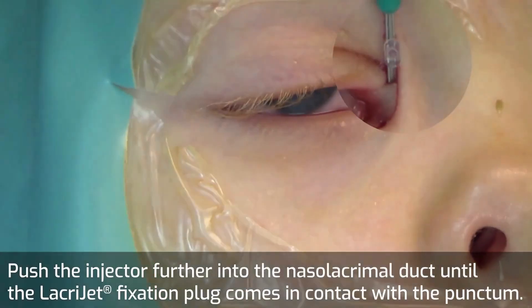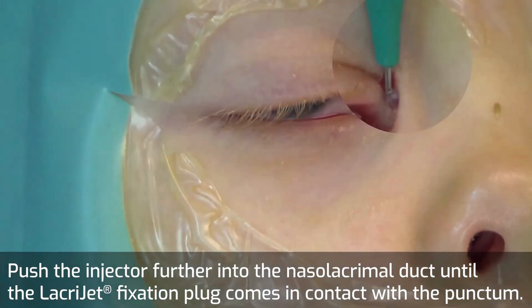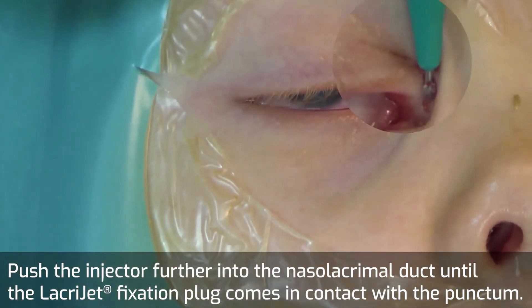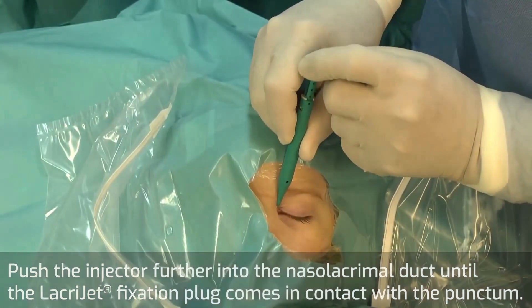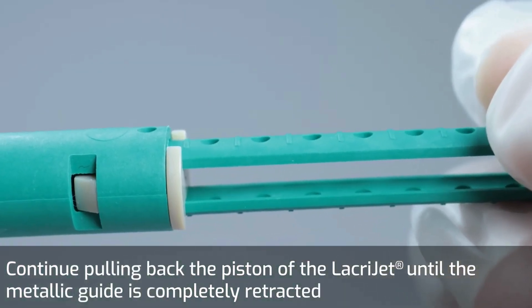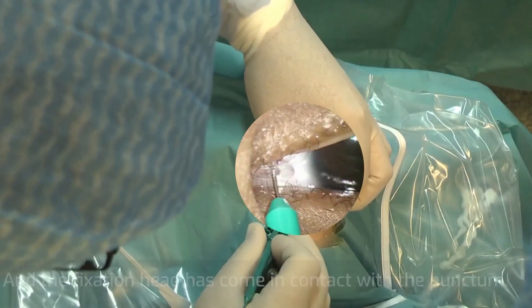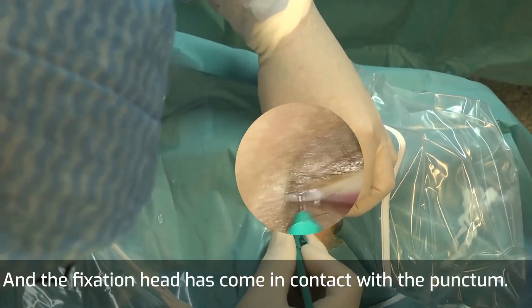Push the injector further into the nasolacrimal duct until the Lacrijet fixation plug comes in contact with the punctum. Continue pulling back the piston until the metallic guide is completely retracted and the fixation head has come in contact with the punctum.